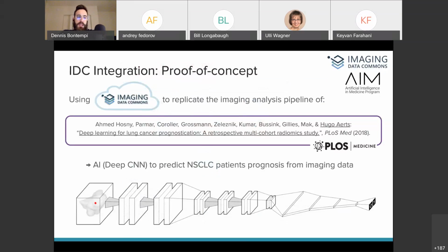Back to our use case, what the authors did in the paper was to design and develop a deep learning model on private data from different sites and test it on the NSCLC Radiomics dataset to make the results available for everyone to reproduce, as they also provided the trained model weights and a number of other useful scripts.